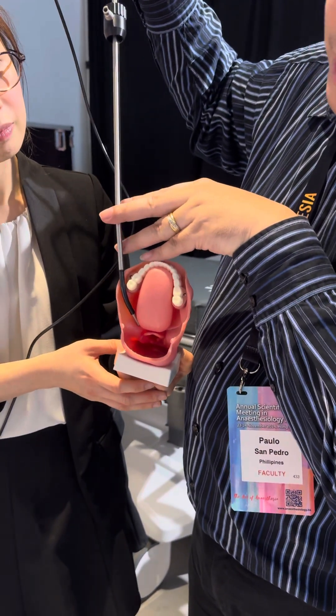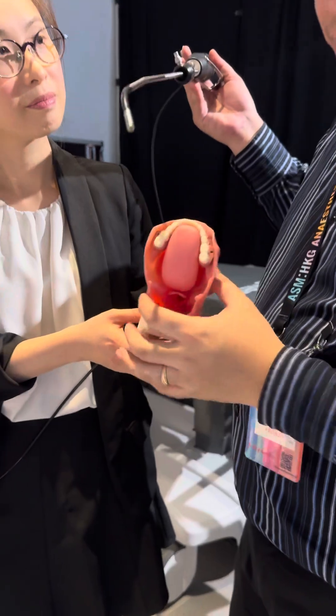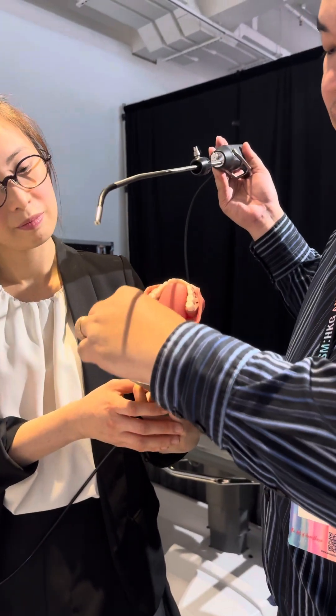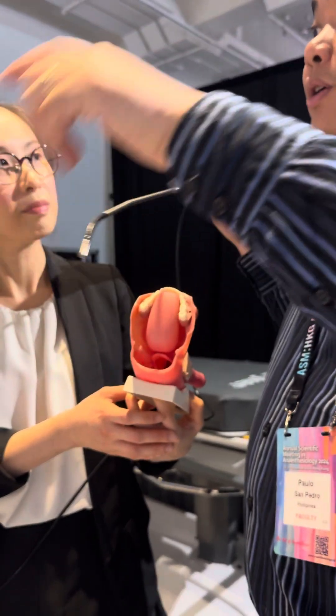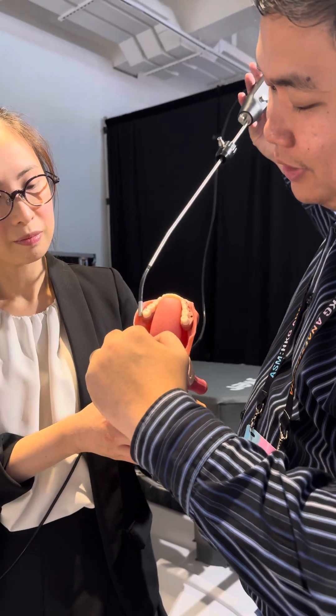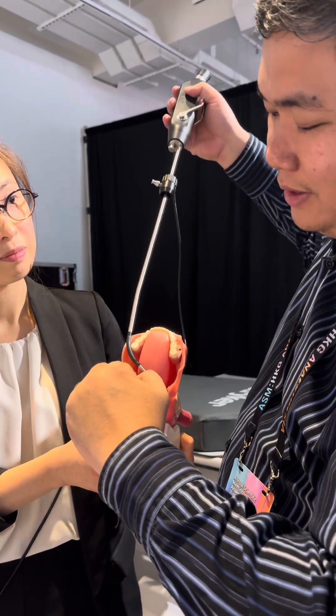They teach it to be done differently, but one reason I do it this way is that the space is very small here — you have a tendency of perforating the glossopalatal area. The glossopalatal fold is right here, so when you enter this way, it's right there. That's why I do it like this instead.